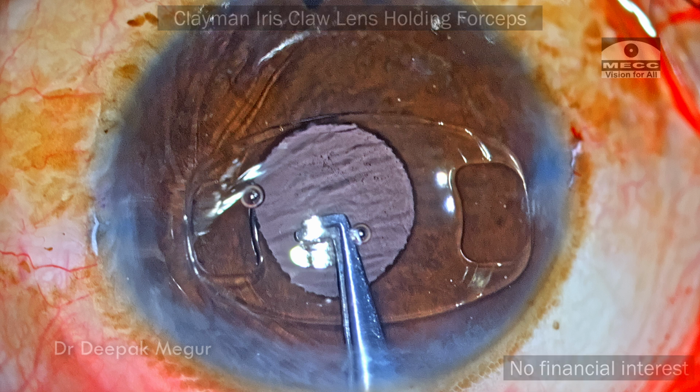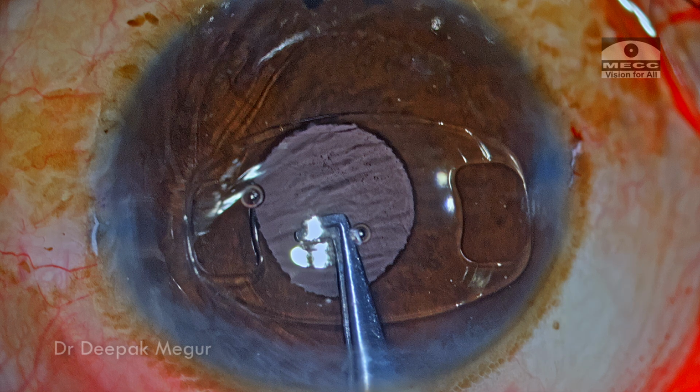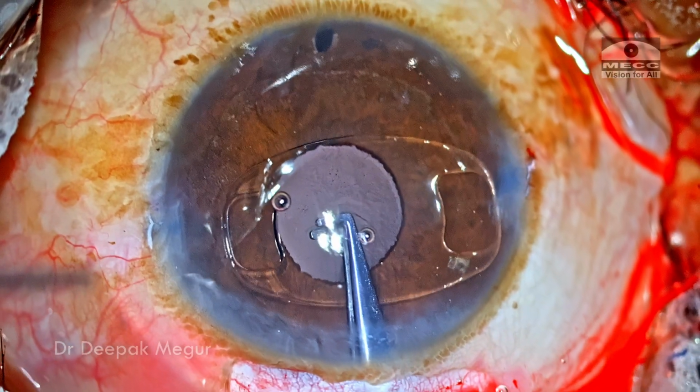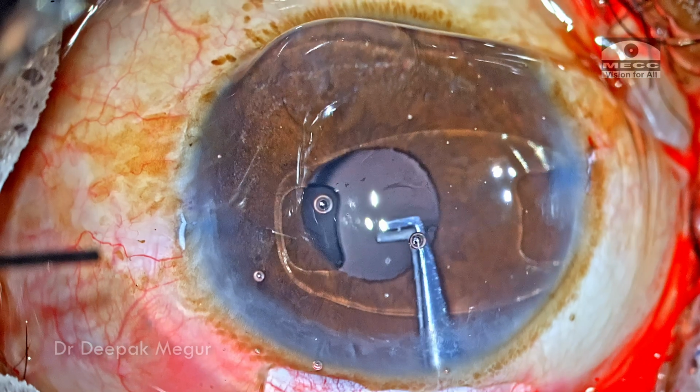In post-vitrectomized eyes, the eye will be very soft, and the visibility becomes an issue because the moment we want to enclavate, there will be a lot of corneal folds because of the hypotony. So having an instrument which is slim helps us a lot. I'm going to hold the lens with the forceps exactly at the position where the claw is present in the haptic. So it's going to provide me the clue about the location of the claw once the haptics go under the iris.